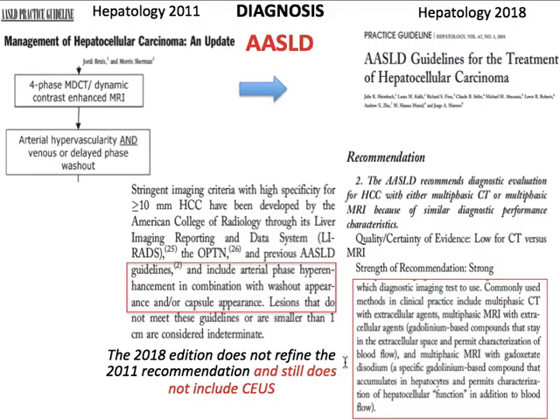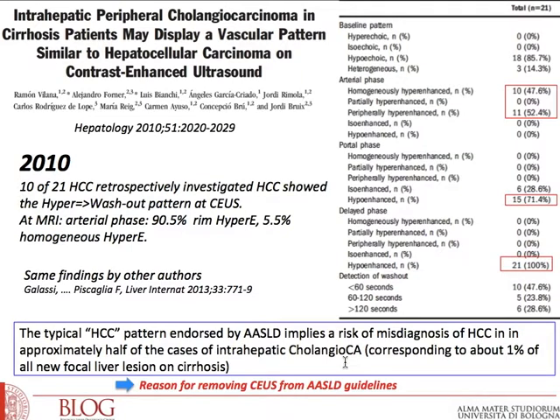And according to this definition, the use of contrast-enhanced ultrasound was prohibited because when we adopt simply this pattern, approximately half of the intrahepatic cholangiocellular carcinomas developing in patients at risk of hepatocellular carcinoma do have the same pattern of hepatocellular carcinoma, and therefore they suffer a risk of misdiagnosis. Altogether, these are very few patients, but actually adopting simply hyperenhancement plus washout is not sufficiently specific.